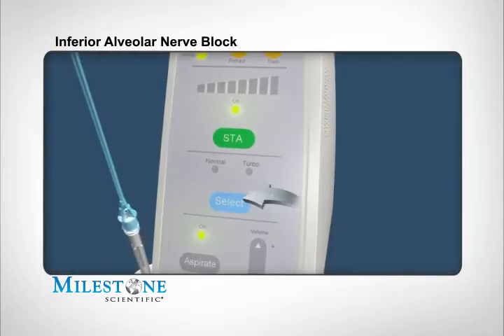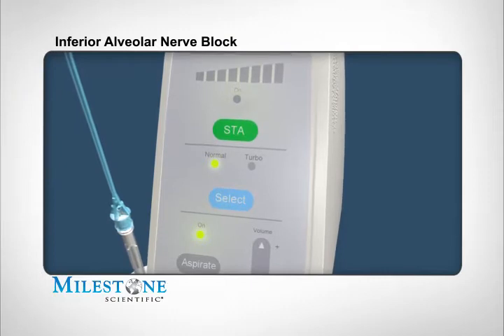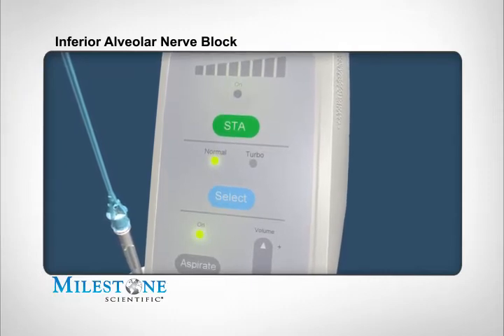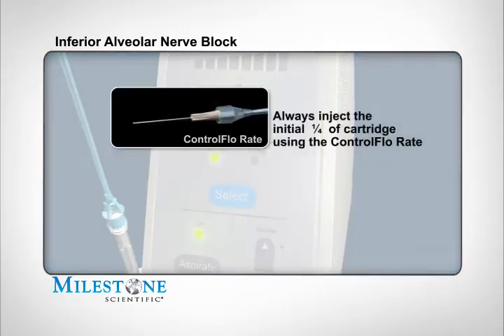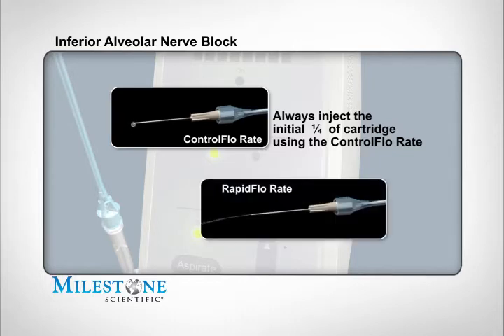Set the STA instrument to the normal mode, which allows the STA to function with two distinct flow rates, the control flow and the rapid flow rate. Utilize the control flow rate to administer a minimum of 1/4 of the cartridge for the initial phase of the block injection. Once the patient feels the onset of soft tissue anesthesia, transition to the rapid flow rate.